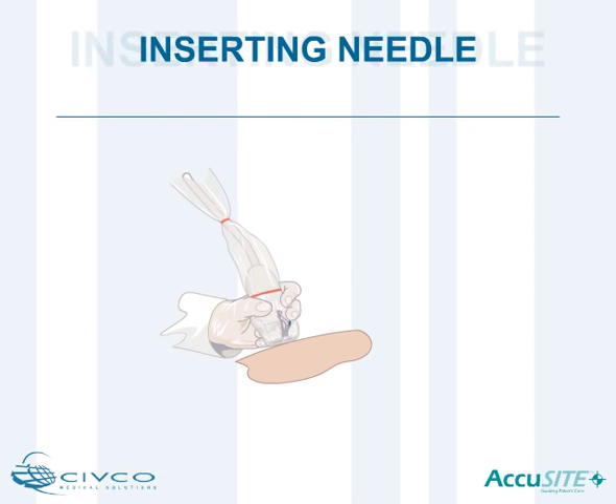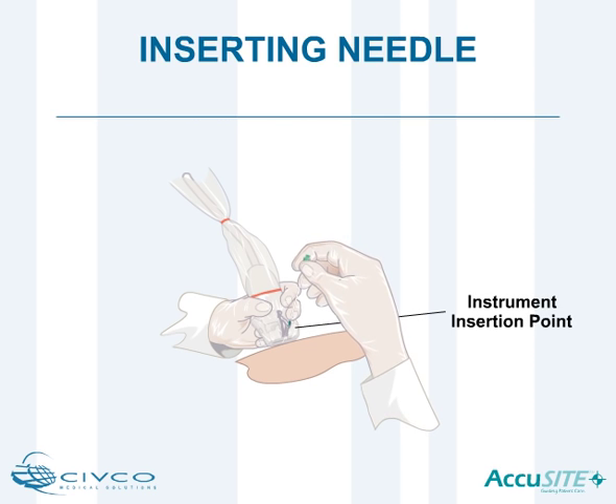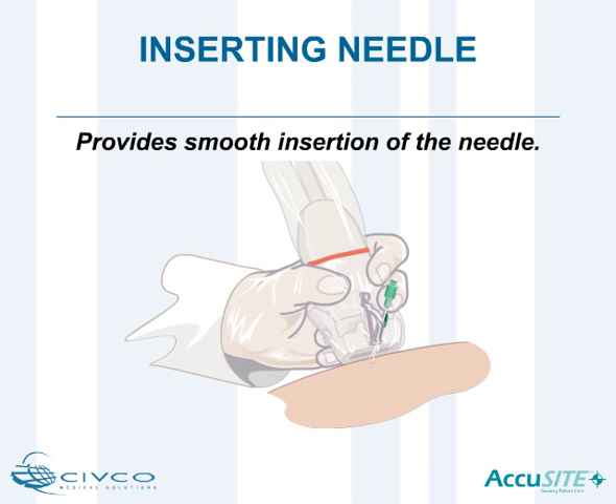Place the transducer and needle guide assembly in the proper location to reach the targeted vessel and insert the needle into the instrument insertion point. AccuSight holds the needle as it is advanced, providing smooth insertion.